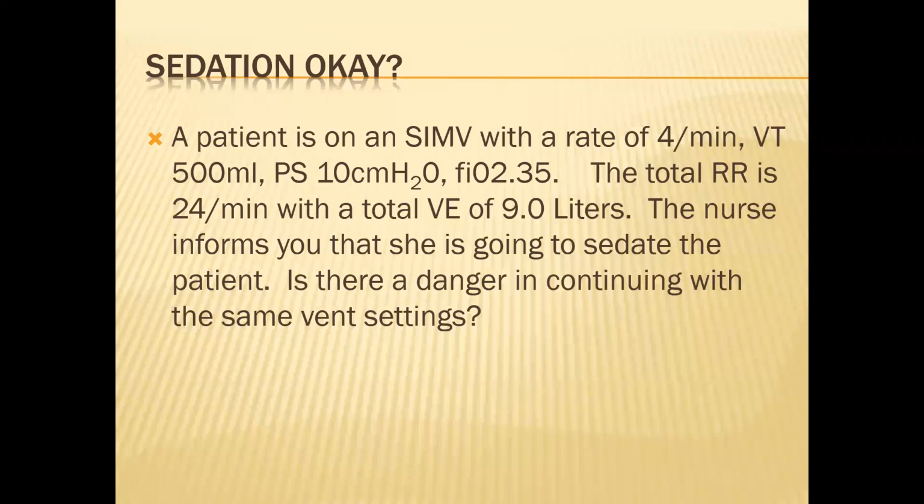The nurse informs you that she's going to sedate the patient. Is there a danger in continuing with the same vent settings? Yeah. Then the respiratory rate goes down to 4 breaths per minute.